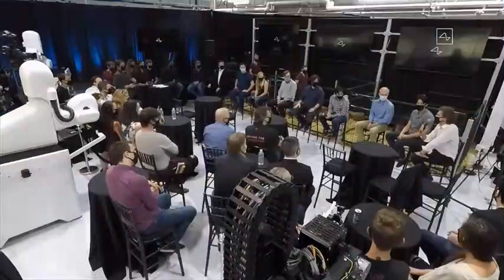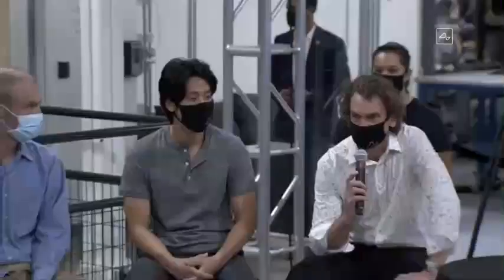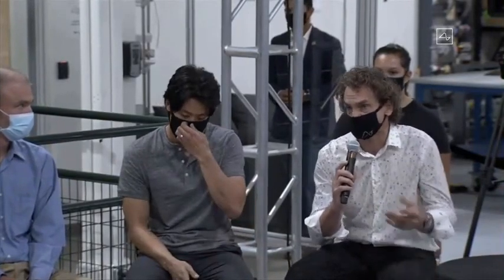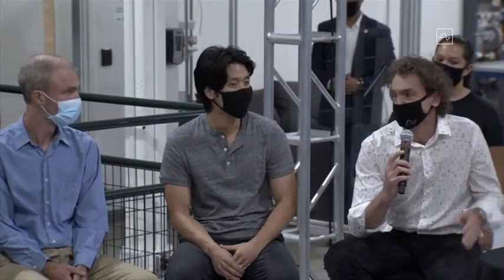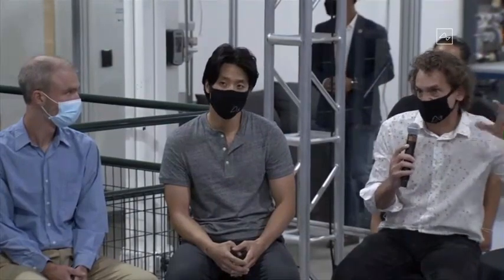Yeah, I think one of the things that's allowed us to make such fast progress in the last few months is the use of pigs as a model. We started out choosing pigs because of the very similar anatomy of their skull to humans, same thickness and a similar dural membrane. But as time went on, we realized that pigs have amazing other properties. You can train them to walk on treadmills and do all kinds of tricks, and they have a large representation of the snout in the cortex, which you can very easily stimulate. So the question would be, why are we using pigs? I think we've even surprised ourselves at how useful they are as a model.